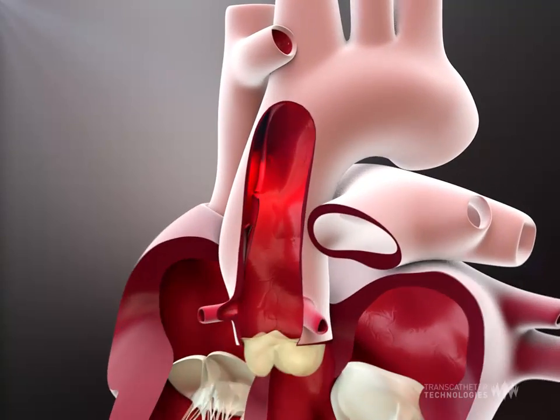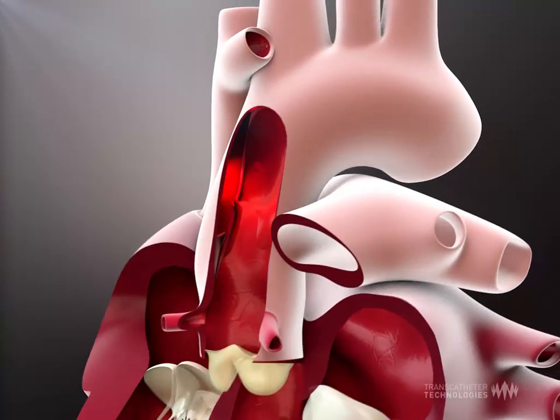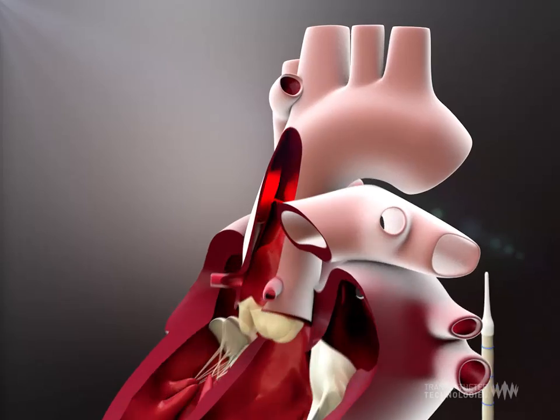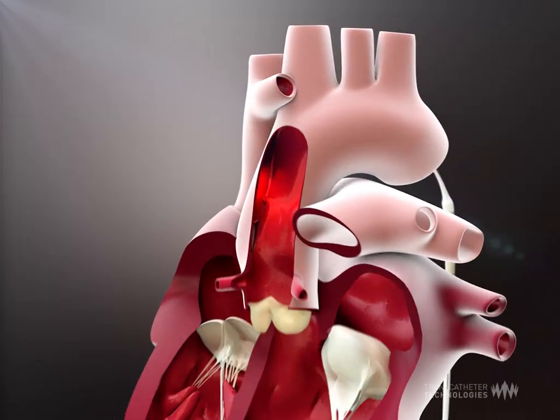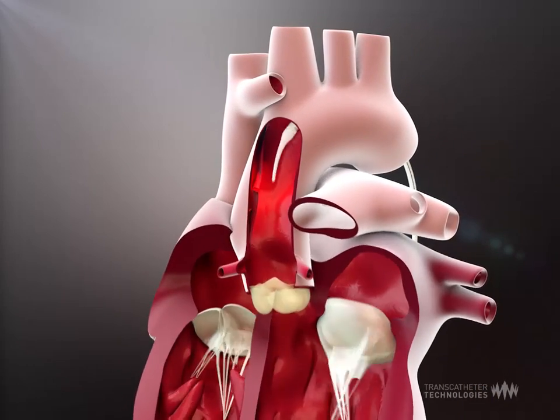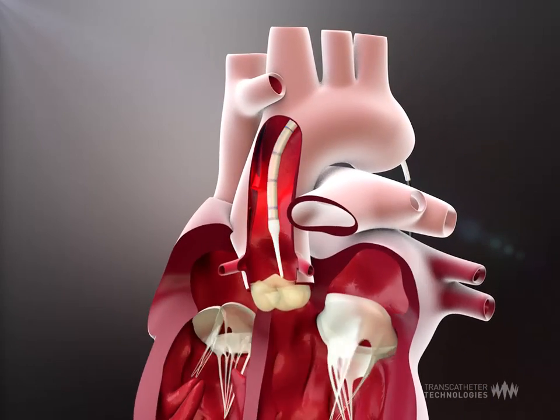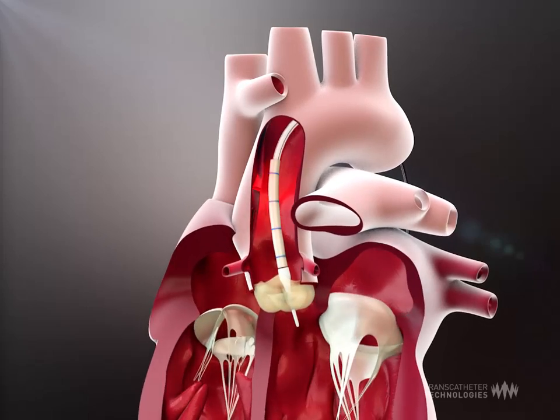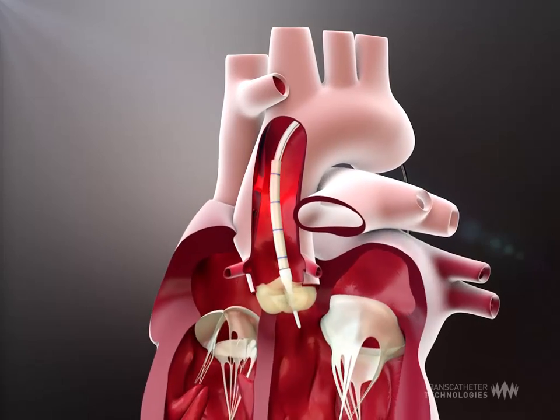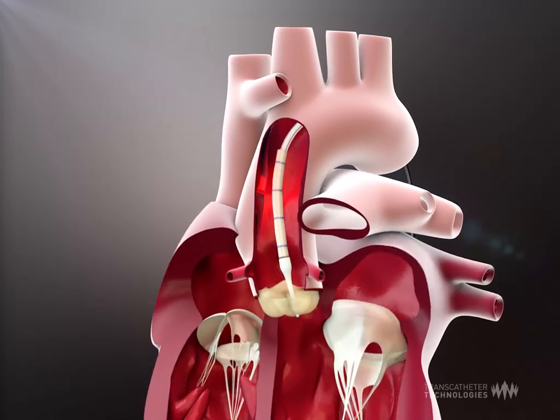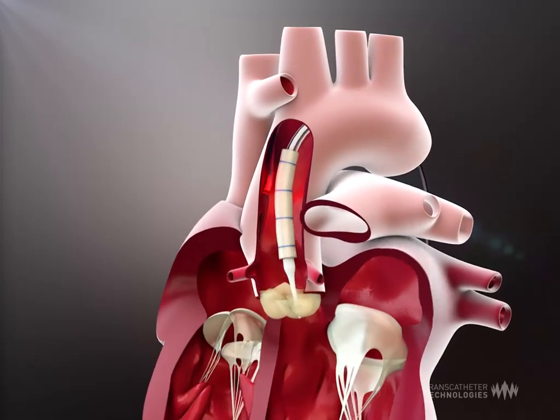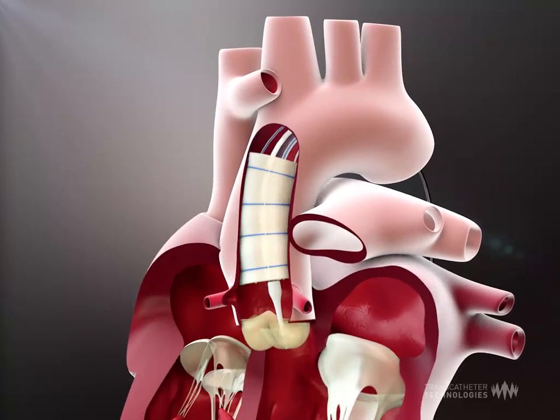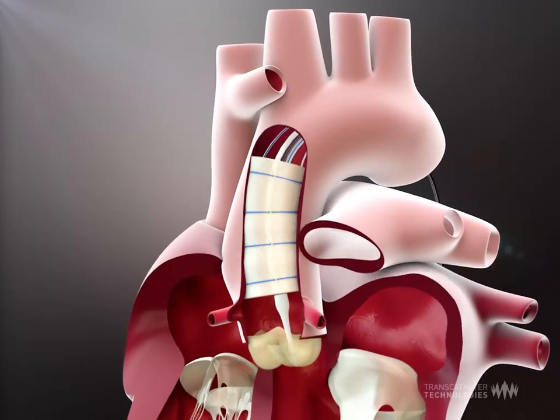In a type A dissection, the catheter is introduced through the femoral artery and retrogradely advanced via the aorta up to the sinotubular junction. The stent is carefully positioned above the coronary openings and fixed in place via precision-controlled expansion.